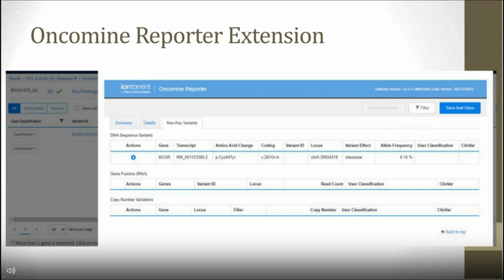If we click on this tab and we see that there's a variant here, or we've identified it previously through our data analysis, we can perform a deeper review of this variant and determine, is it applicable to the case that we're profiling? Is there anything of significance that this might be worth reporting out as a relevant finding on the case? And if we determine internally that this is a worthwhile variant to include as a relevant variant on the case, we have the ability to promote that.